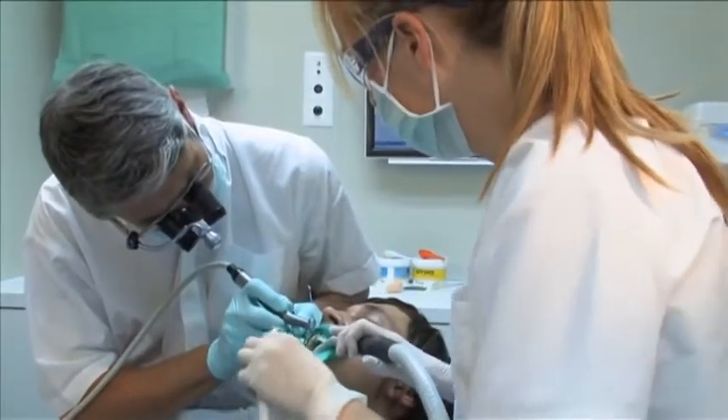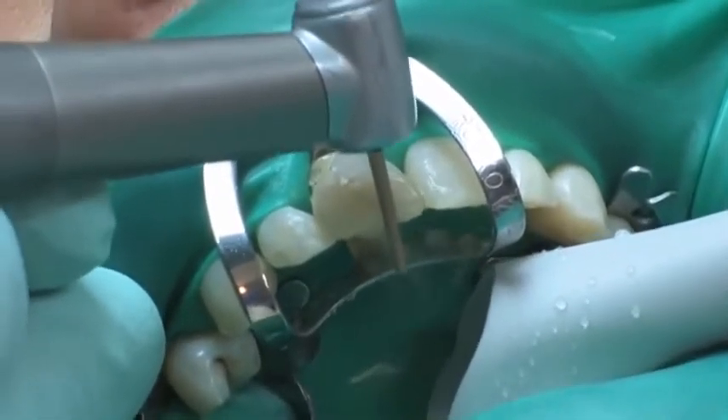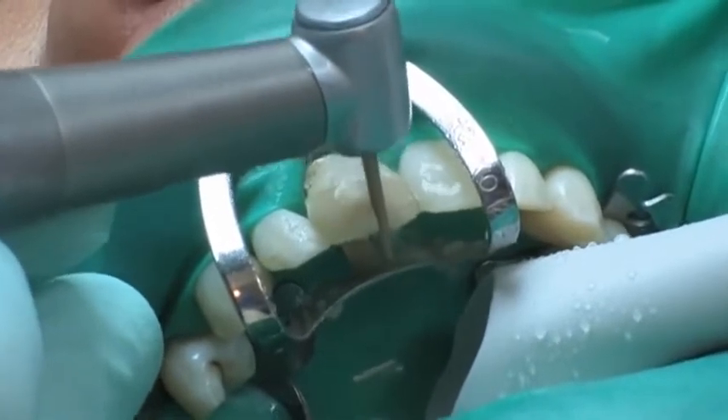The old non-aesthetic restoration is removed completely using a 125 micrometer diamond instrument until the pulp chamber is exposed.